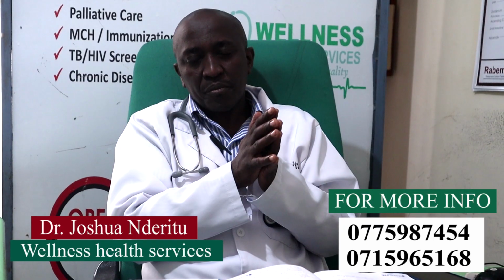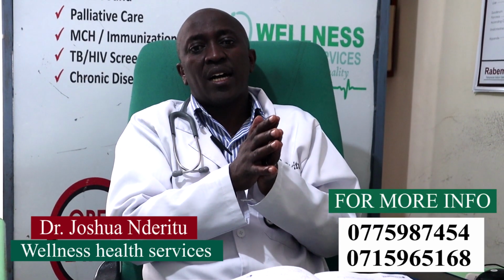So in summary, a chest X-ray is a common investigation in healthcare, usually taken from the posterior part of the body to the anterior, but in very sick patients, sometimes you can do an anterior to posterior, but this one is not very good in assessing the heart. You can also do a lateral view, which is taken from the sides, and it is usually used to diagnose pathologies in the lungs, the heart, and the middle part of the chest.